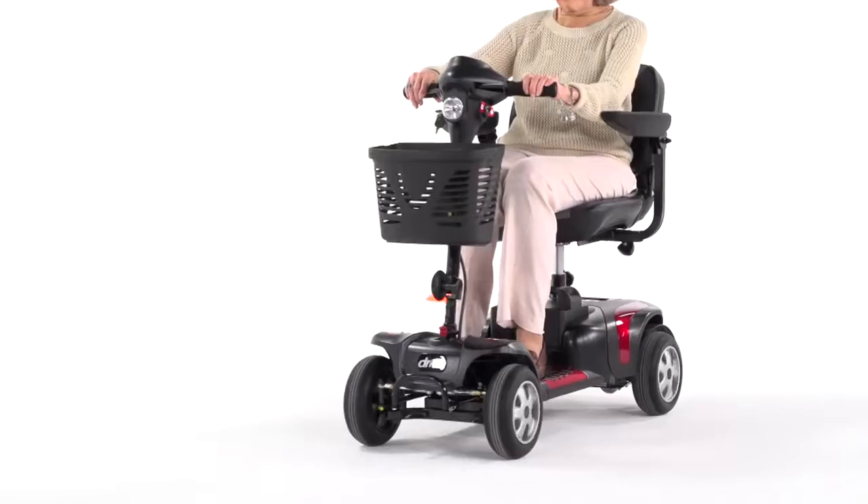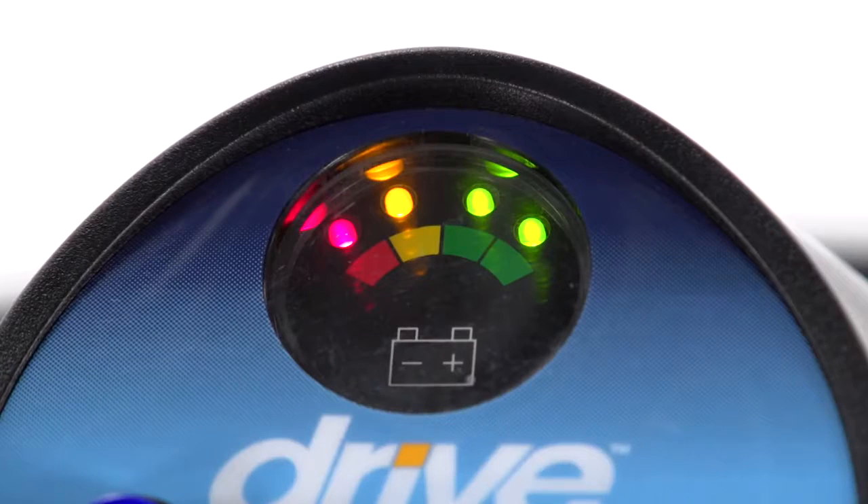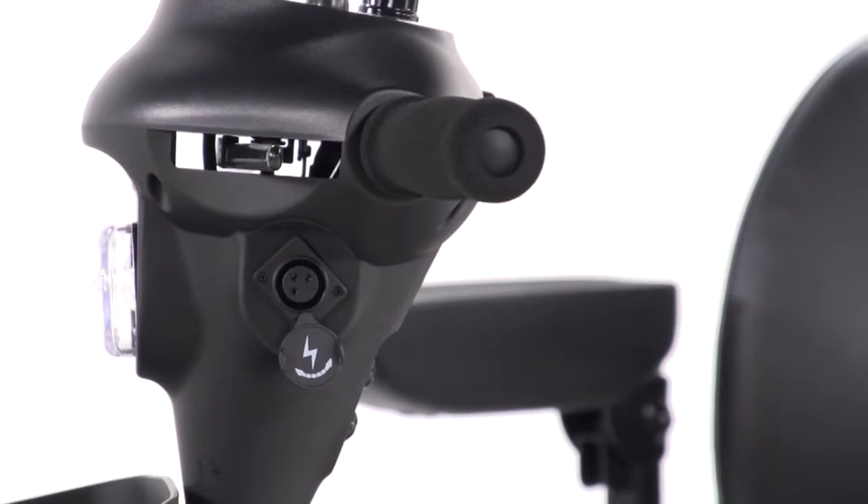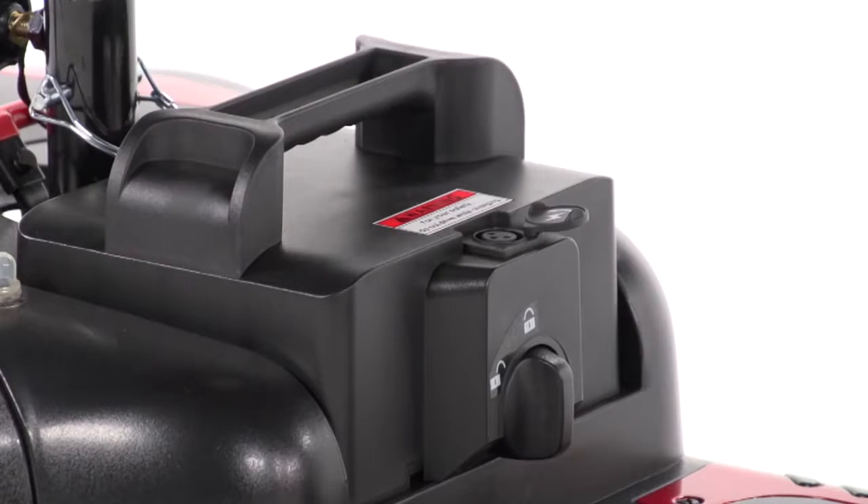With the Phoenix HD 4-wheel version, you get excellent stability when traveling over outdoor terrain. And when the battery gauge shows the need for recharging, it's simple from either the port on the control panel or the battery pack.